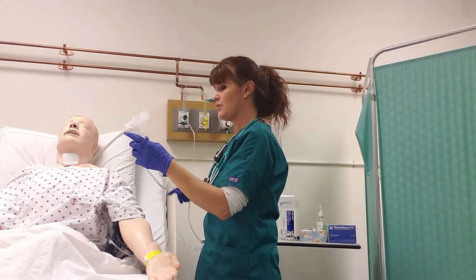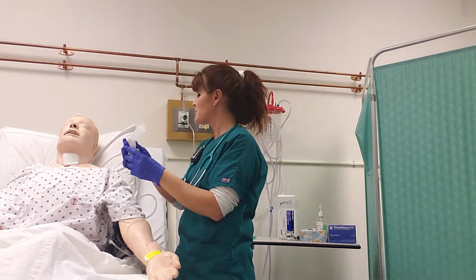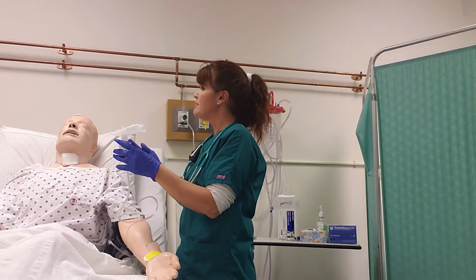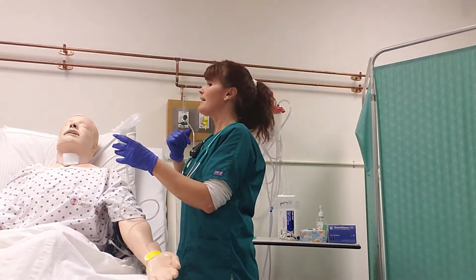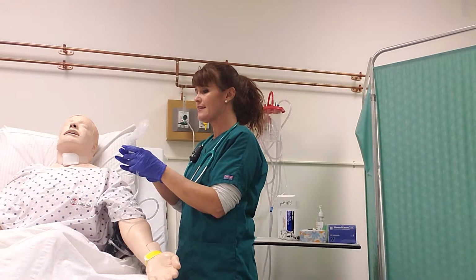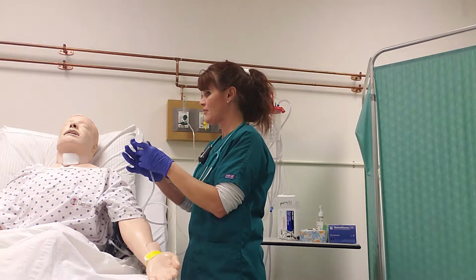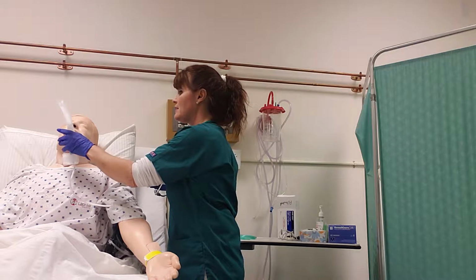All right, Mr. Wilson. So if you just hold this for me, now what I need you to do is wrap your lips around this tightly and breathe in and out regularly. Maybe every minute or two, take a nice deep breath and hold so we can really get this medicine depositing in your lower airways. It's going to make you feel so much better. All right, do that for me, please.